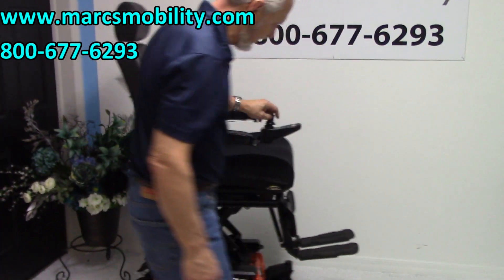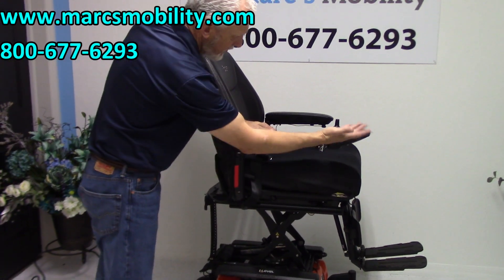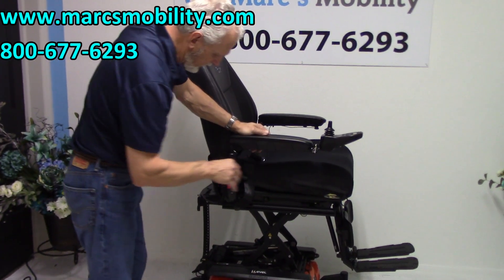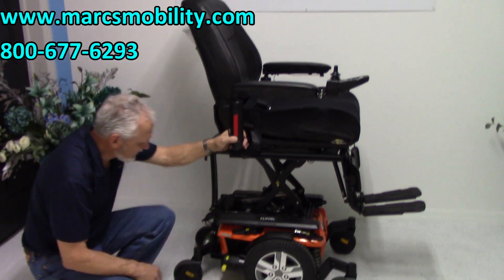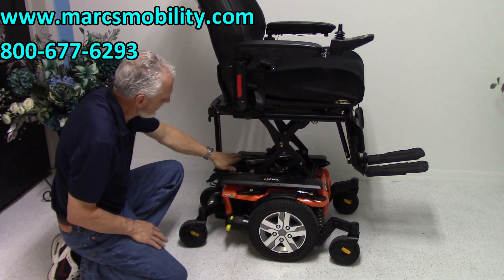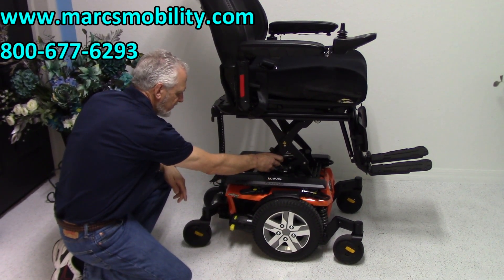This chair is practically new. It was only used for two or three months, as you can see — no scratches, no nothing. Practically brand new. It does have the 12-inch seat lift. If we look under the chair, we can see the seat lift armature right here. You can actually see the actuator right here for the seat lift, and the motor for the seat lift is right here. You can see how well constructed this is.